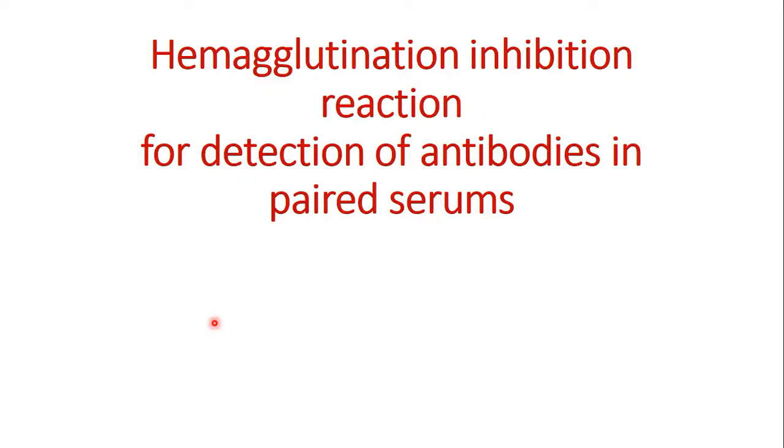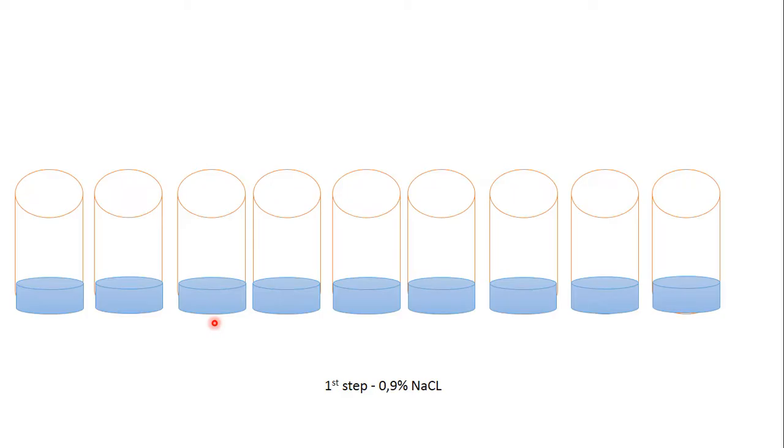Hemagglutination inhibition reaction for detection of antibodies in paired serum. For this reaction we use 6 test tubes and 3 control tubes: a serum control, antigen control, and RBC control.